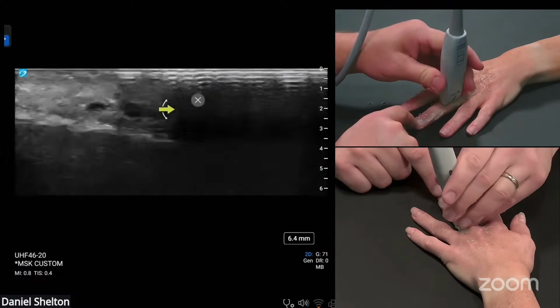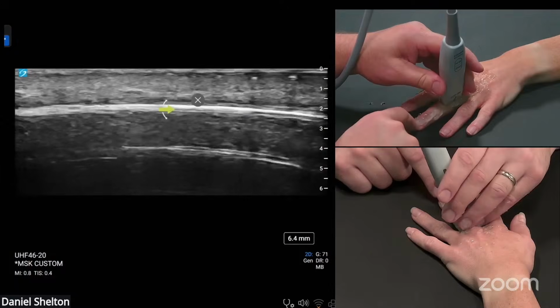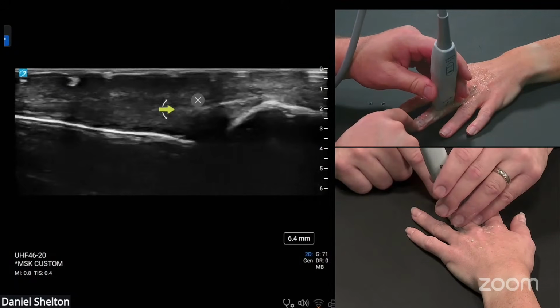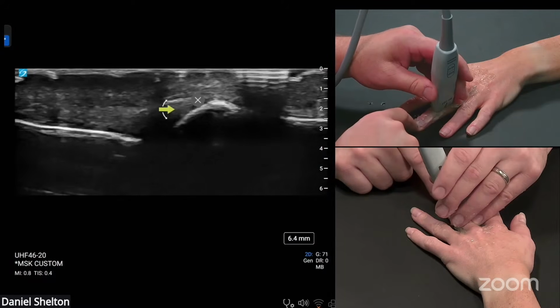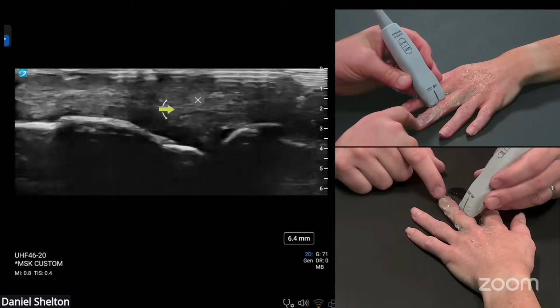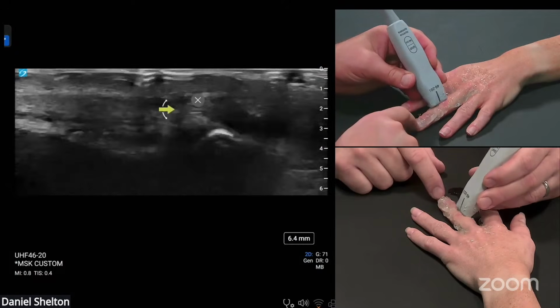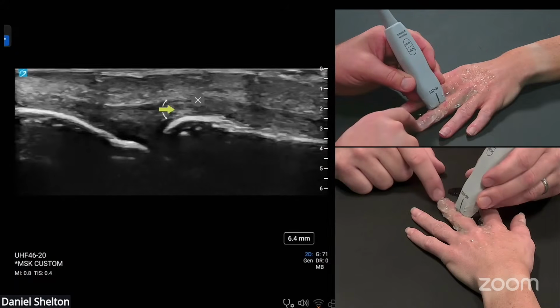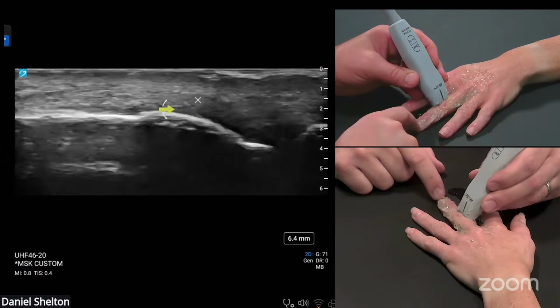You can go extreme dorsal right there and get some of those fibers to move, but they're really thin, and a lot of them attach right here on the PIP. So we're not catching all of the extensor fibers, but if you go to the side of the PIP, you'll catch those kind of traveler tendons that go down and all work together to insert at the DIP level.